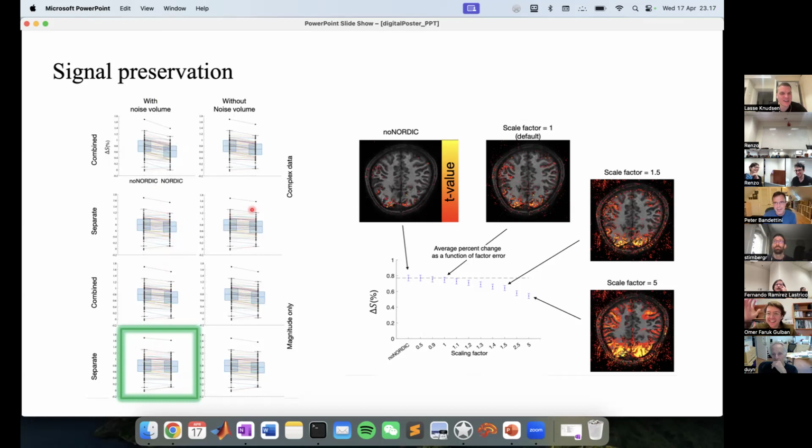No, not now. I think we got the point though, that we don't have a ground truth, right? So do we want white matter activity? Can we really say that this is all false activity? Do we want more activity, or is there anything like false positives? We know from Javier that there isn't.